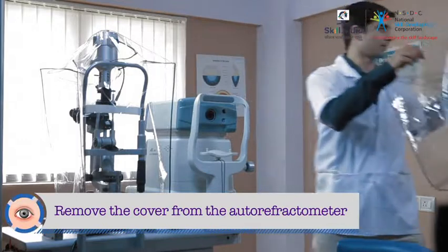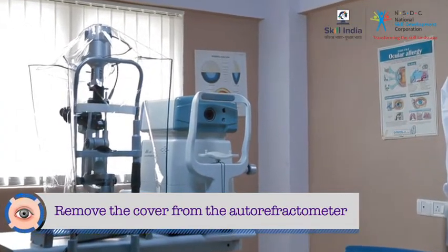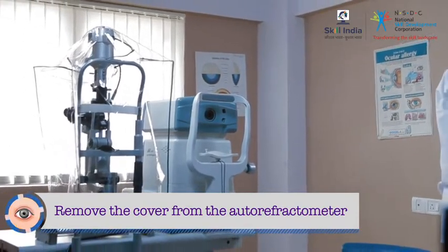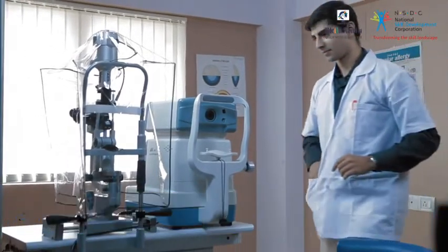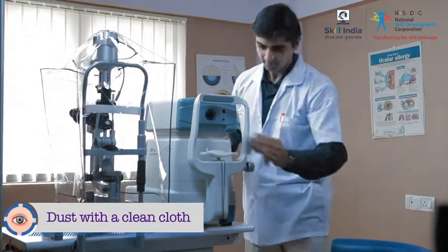Keep the cover in a safe place and put it back on the instrument once the day is complete. Step 2: dust the auto refractometer with a clean cloth.